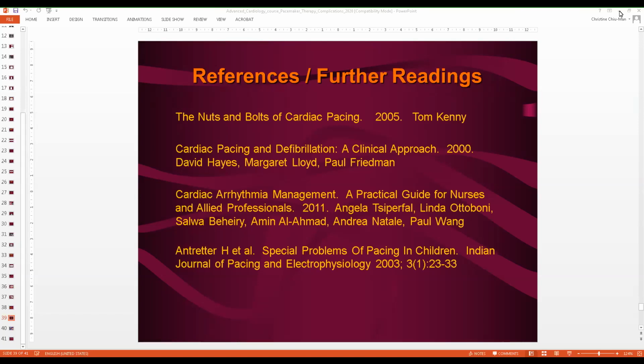Oh, so when they're really small, I'm sorry, I seem to have lost my Zoom connection. Okay, so I can't see you. So when they're really newborn, they are done in the operating room epicardially, so with the lead attached to the outside surface of the heart. And the smallest that I recall that we have done would be certainly 1.5 kilograms. But I'm wondering, I also had a baby that was 1.2 kilograms, so it's really, really tiny.